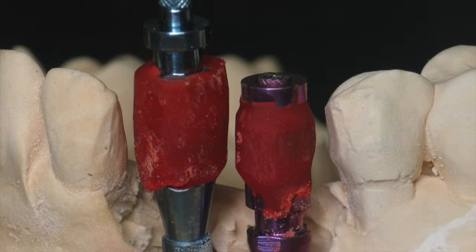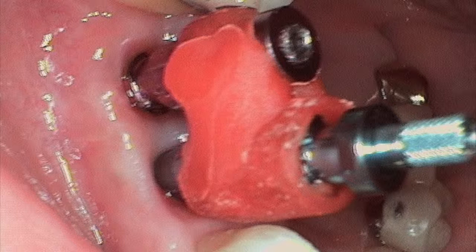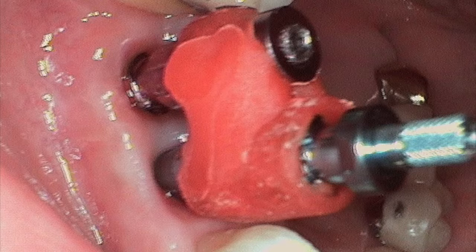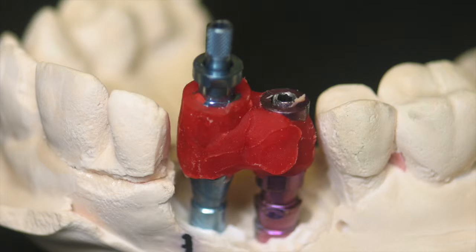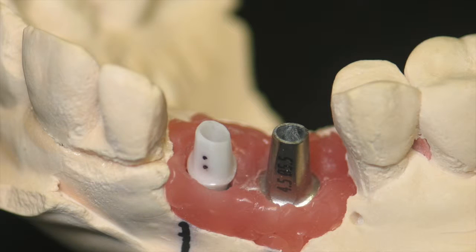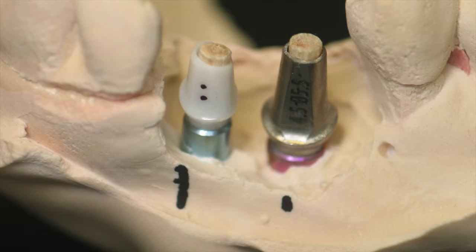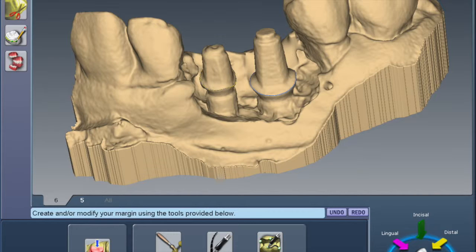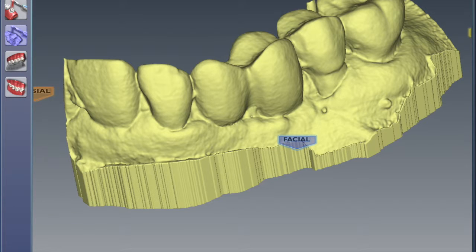In this particular case I chose to link the abutments with a single restoration, so I wanted to notch up my model accuracy. Before the next appointment I prepared impression abutments on the model with Duralay, linked them together in the mouth, and took a final pickup impression. Under scan model, the new impression with the final abutments placed and the soft tissue model removed needs to be scanned. Under scan clone or pre-op scan, depending on your software version, you need to scan the provisional placed in the mouth.